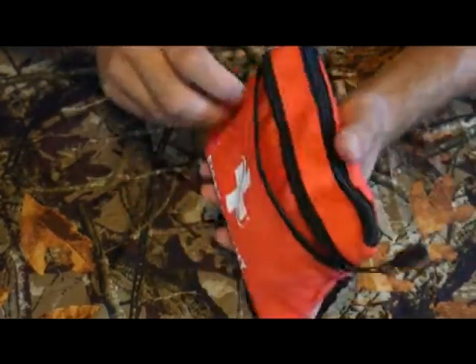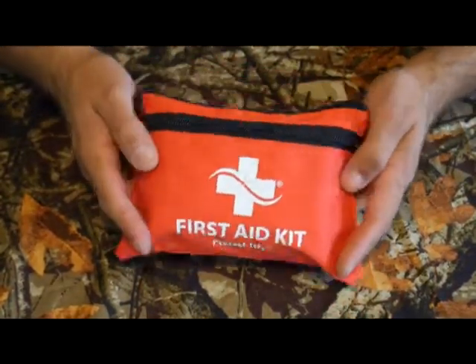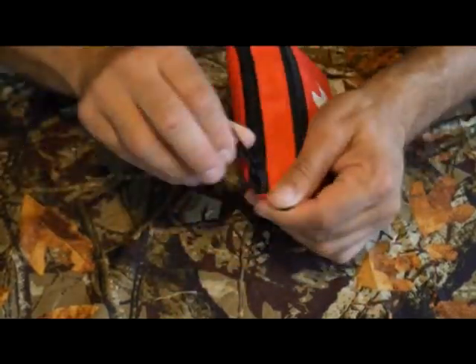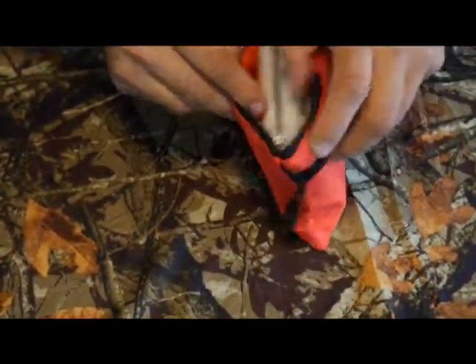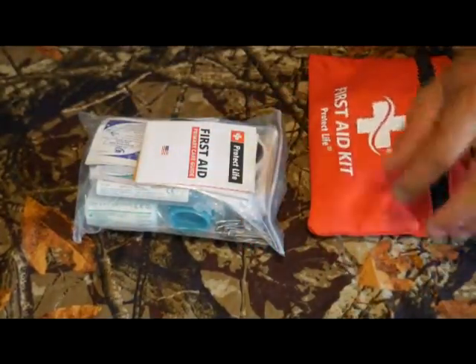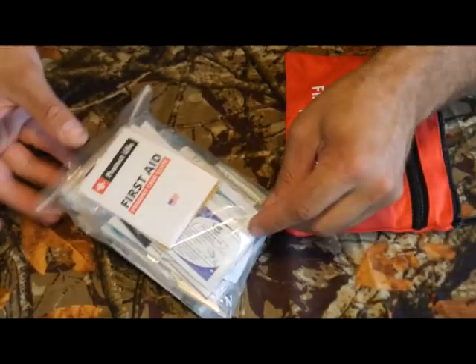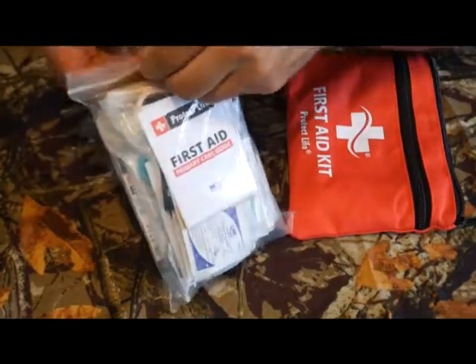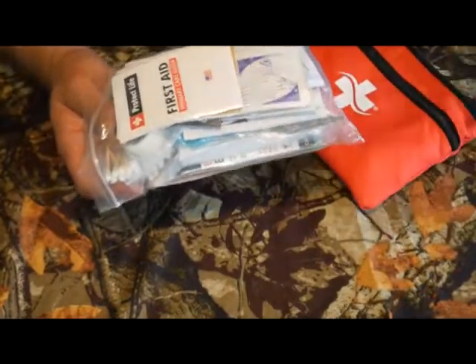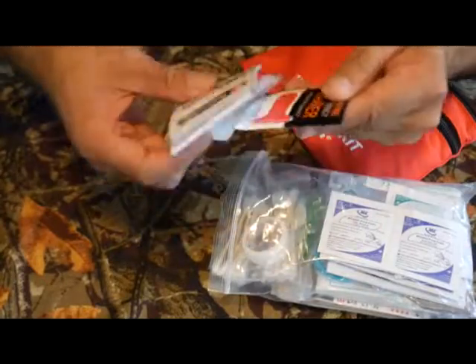They market this as a first aid kit for hiking, backpacking, survival gear, bug out bags — that type of thing. Let's see what's in here. Everything is in a ziplock bag, which right off the bat is very good. Most first aid kits do not come in a waterproof sack, so props to you guys for that.